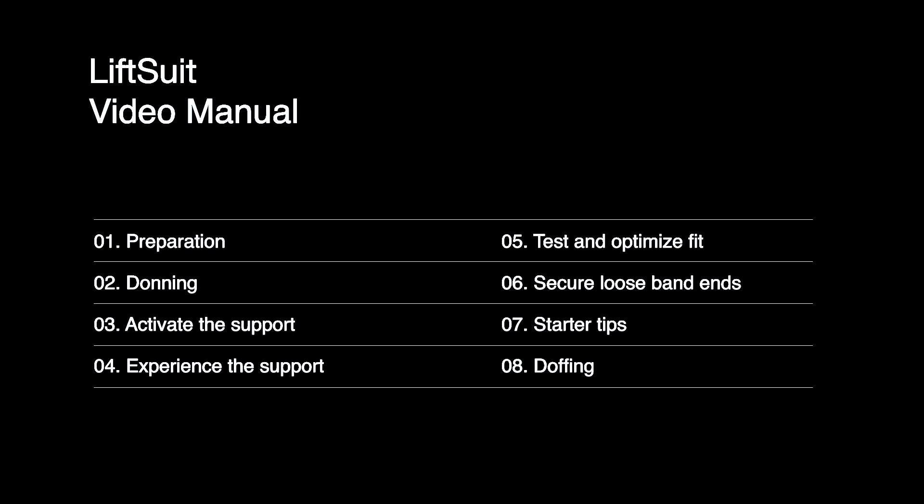In this video, we will explain the different steps in more detail to make sure you can quickly experience the support of the LiftSuit firsthand.